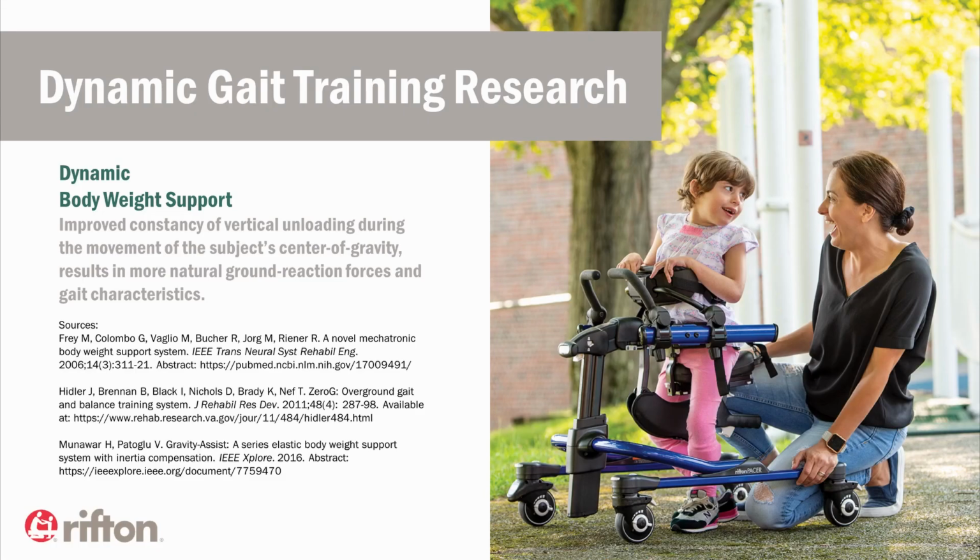Now, there's very little research so far on dynamic gait training systems, but we do know that systems that move up and down improve the constancy of the vertical unloading during gait. By providing body weight support that moves along with the movement of the subject's center of gravity, that results in more natural ground reaction forces and gait characteristics.